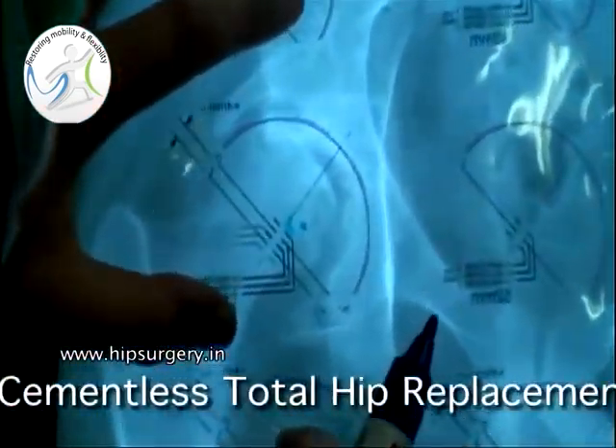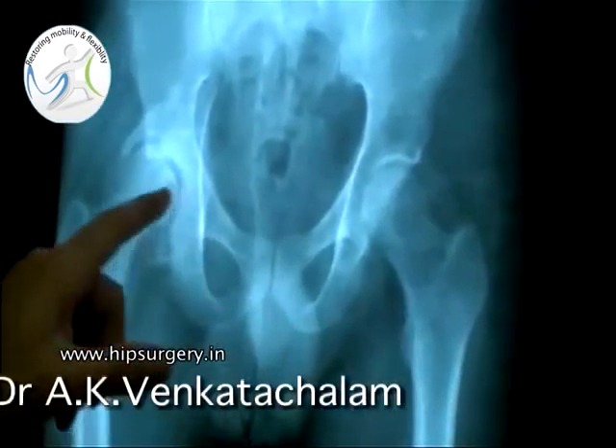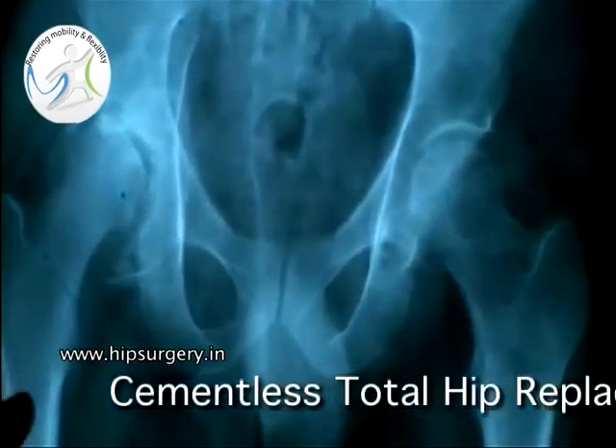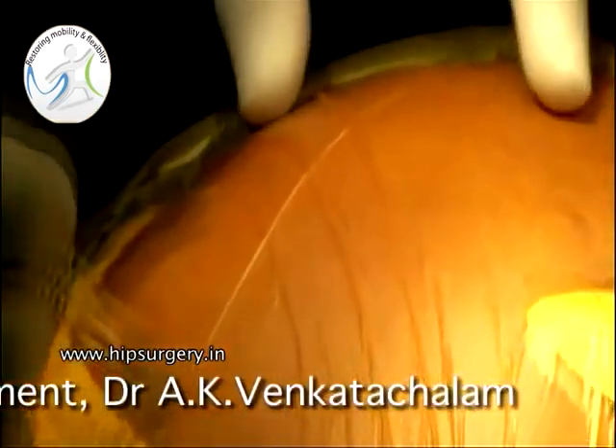Templating is done to locate the center of the hip and to determine the size of the uncemented or cementless prosthesis, and to locate the center of the hip.